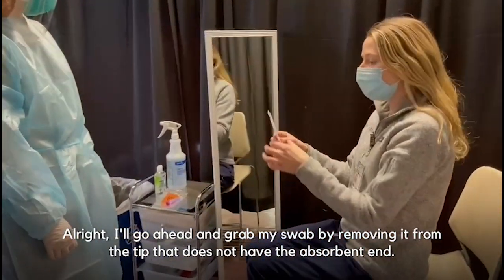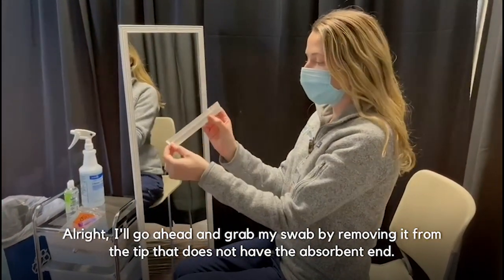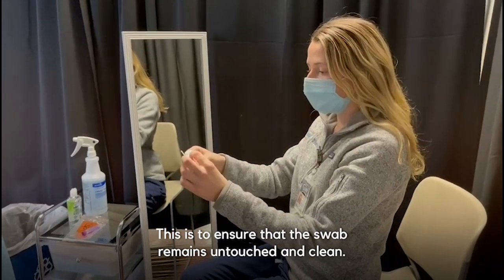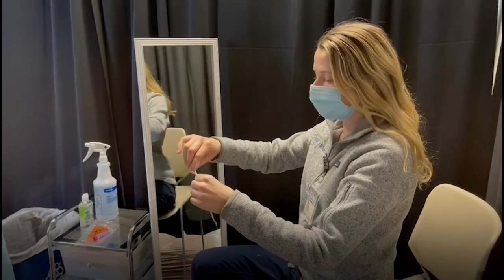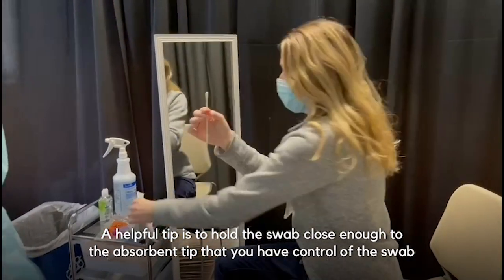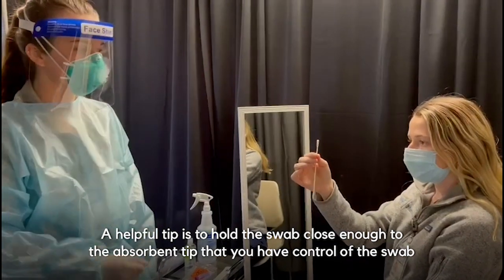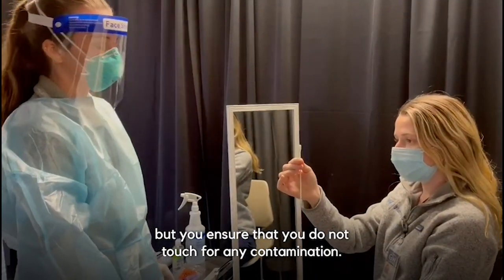I'll go ahead and grab my swab by removing it from the tip that does not have the absorbent end. This is to ensure that the swab remains untouched and clean. A helpful tip is to hold the swab close enough to the absorbent tip that you have control of the swab, but ensure that you do not touch it to cause any contamination.